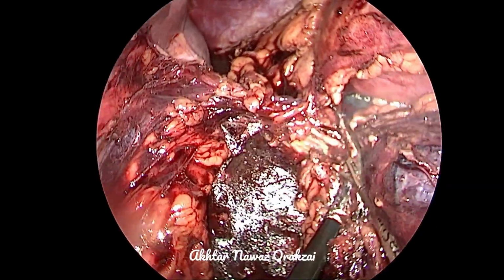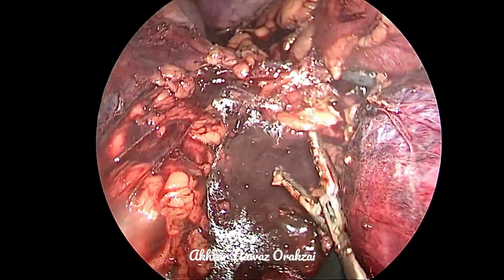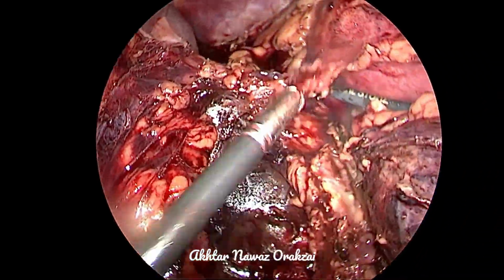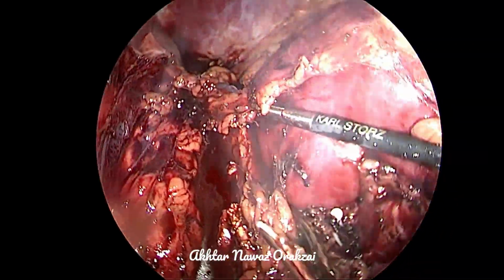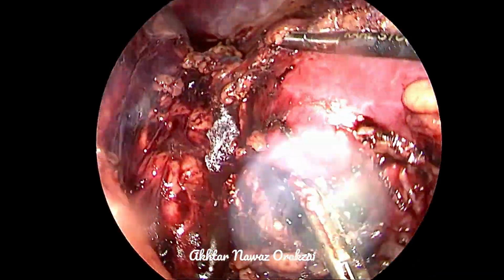We don't mind so long as it doesn't bleed. We know that mainly two arteries have been ligated and divided. The vein has been ligated and divided. So this is the area where there might be an inferior phrenic artery.